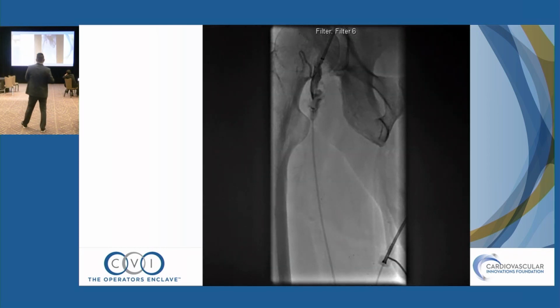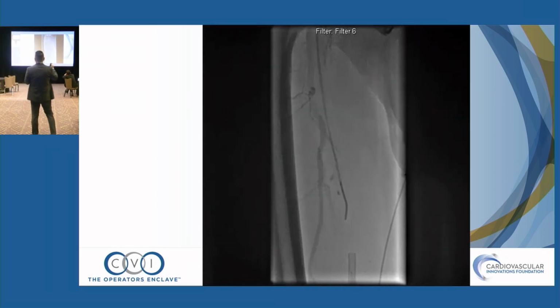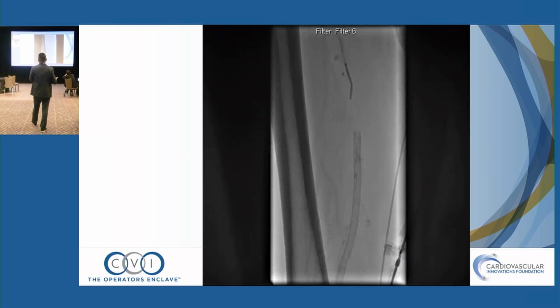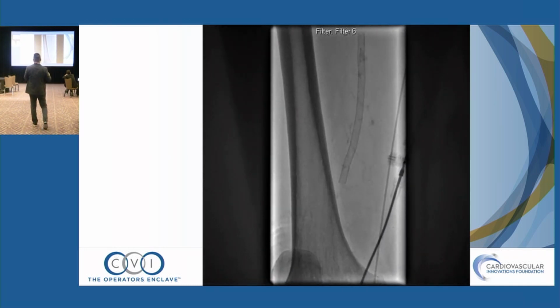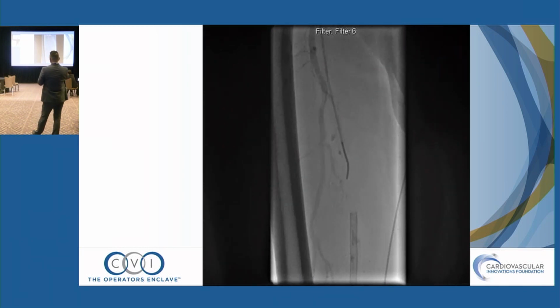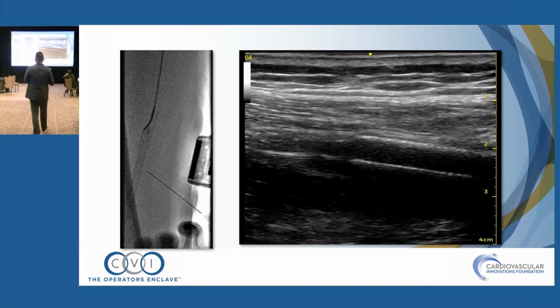Good. So definitely could stick the posterior tibial, and again, I don't remember exactly why, but remember, this is a claudicant. Depending on where you practice and how comfortable you are, you don't want to hurt the runoff vessels. So in this case, this is an occluded stent. So this is what we typically do now. If you're going to do under fluoroscopy, you typically go contralateral view about 30 degrees, because the vein is usually sitting behind it in the other direction.